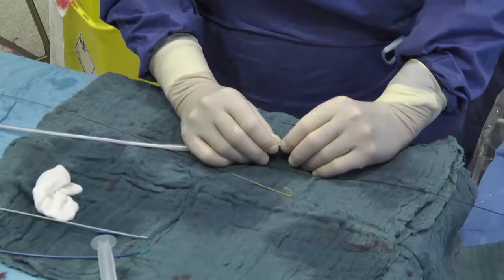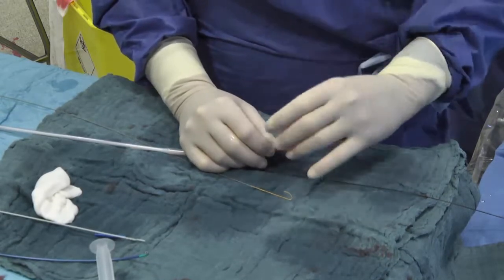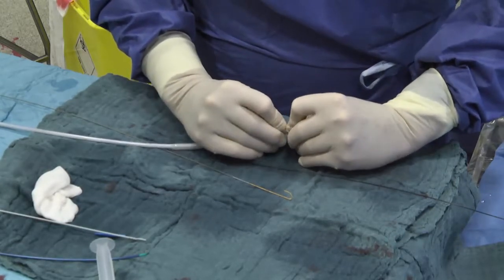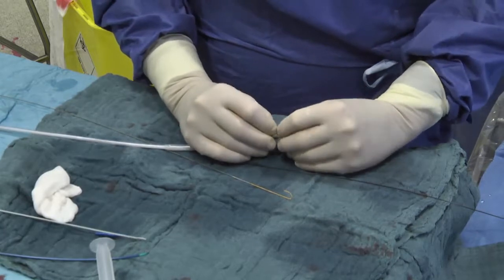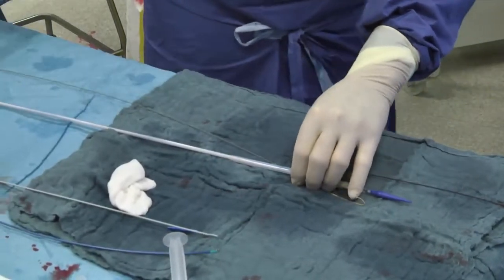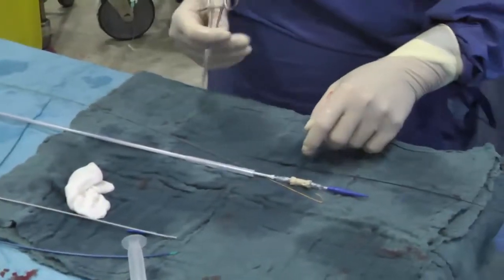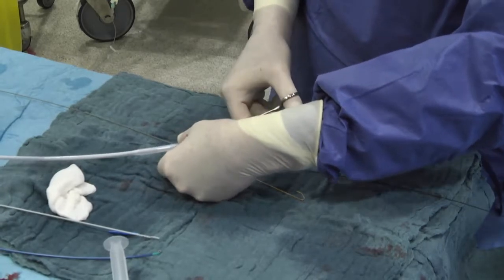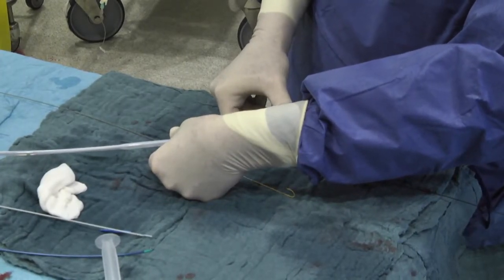Now, the thing that Ziad, you mentioned at the placement of the stent, you said you would have preferred the proximal part of the stent to be flared. I fully agree with you, but very often I am also happy that the stent stays in place and doesn't fly away. And so you really need guts to manipulate that stent after placement in this situation. As a matter of fact, on Saturday morning I have a talk on embolizations of stents, and I will scare the hell out of you guys by showing examples of what can happen if you fiddle around too much with the stent. So usually when I put this stent, I agree with you.